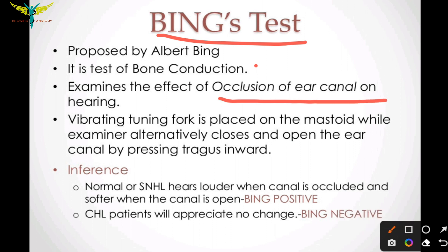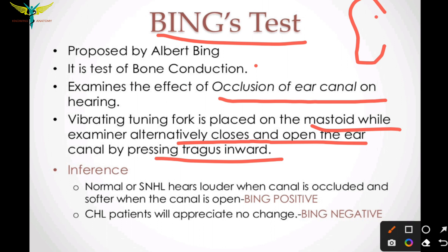The procedure involves vibrating a tuning fork and placing it on the mastoid bone, while the examiner alternately closes and opens the ear canal by pressing the tragus inward. The vibrating fork is placed on the mastoid and the external auditory canal is opened and closed alternatively.